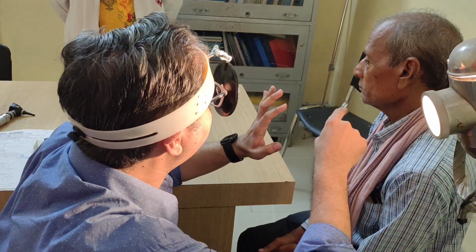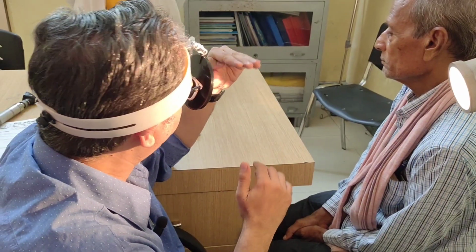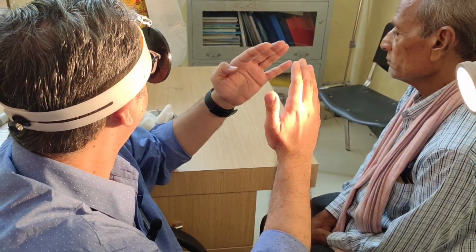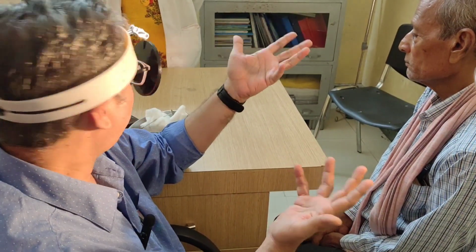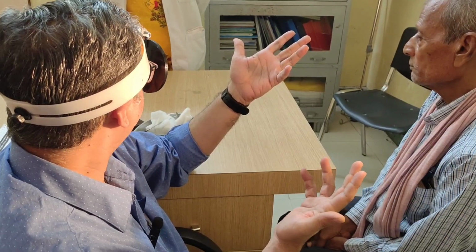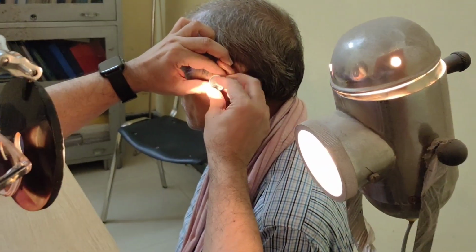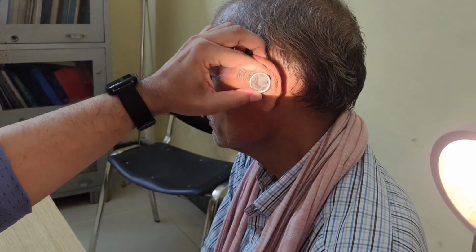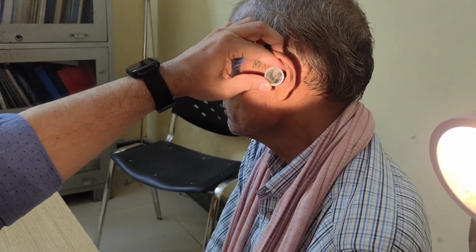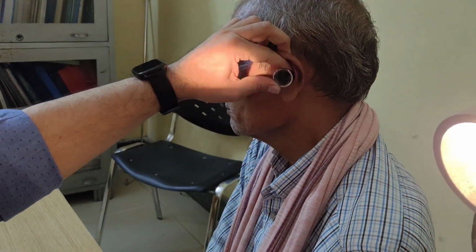Then you comment about the tympanic membrane part, that is the pars tensa, and the part that is above the malleolar folds is your pars flaccida, or it is also called Shrapnell's membrane. So you have to have a clear view of the tympanic membrane, both the pars tensa as well as the pars flaccida. Then the next point that you commonly have to comment about is the perforation on the tympanic membrane.